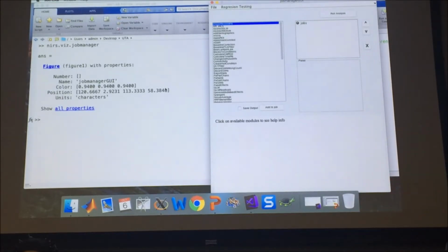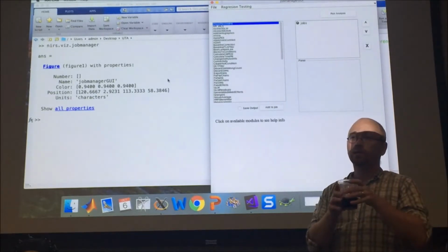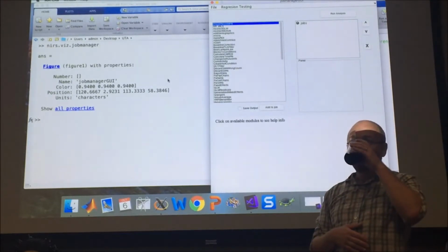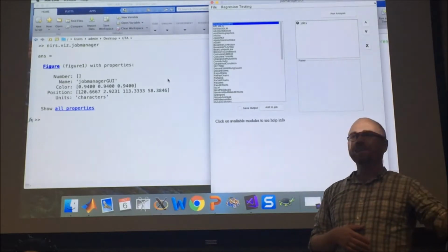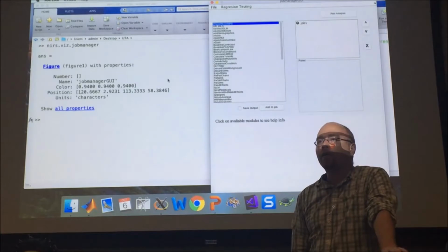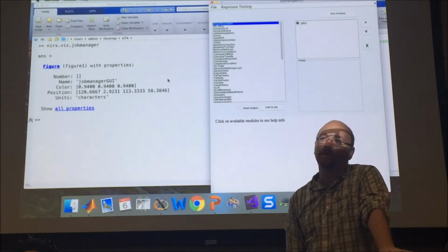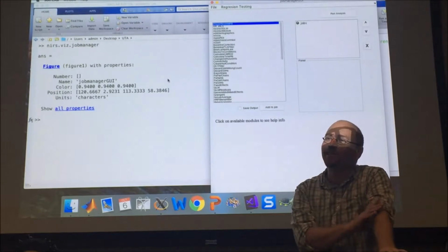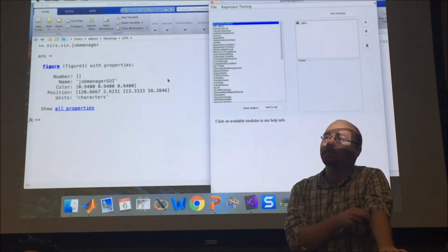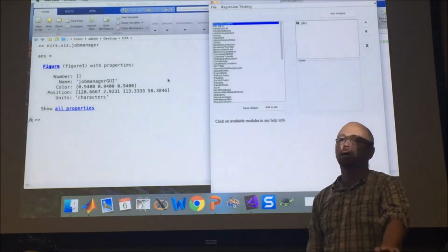Can I ask a question? Yeah. I was just wondering, if you do want to do coding from the command line, I assume you have all these functions documented, right? Yeah, they're documented better than the Homer 2 stuff. Okay. They're not documented to the point that a software developer would probably slap me for how poorly I am at this stuff, but they're reasonably documented, and the demos are very documented. Okay, thank you.